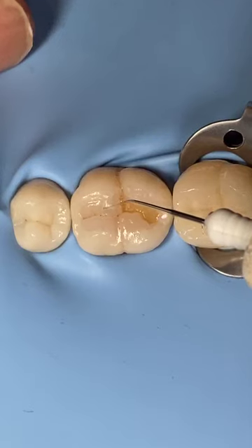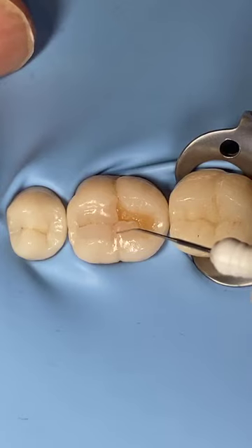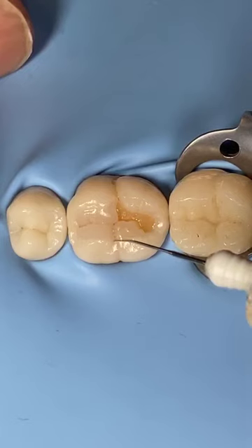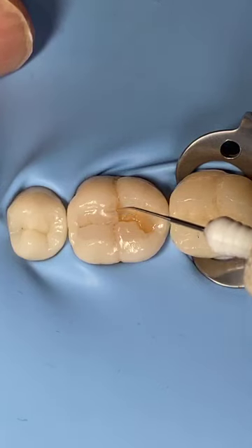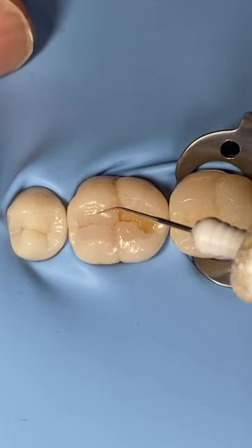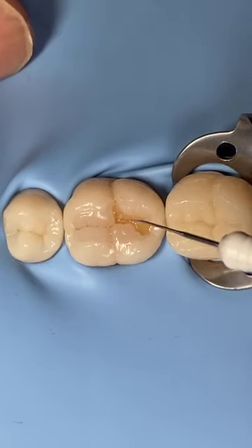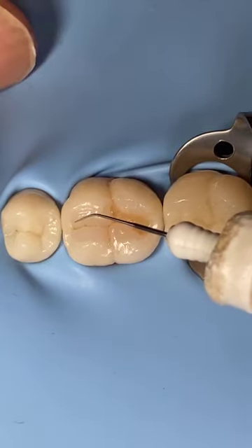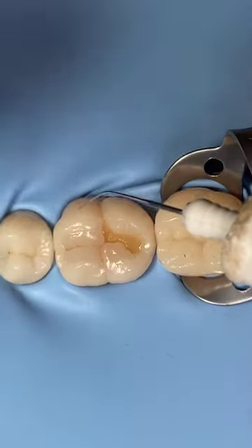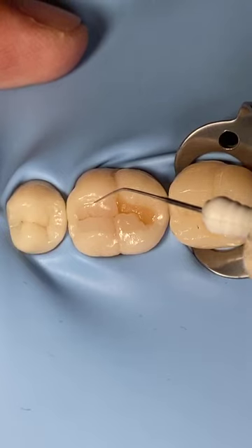Dot. And this one also dot. So remember, this is the dot technique. Dot or stabbing technique, just step, just like you're doing aerobics, step. Now it's way easier for you to do scratching. Yes, scratch, with the guidance of the composite that is already set.